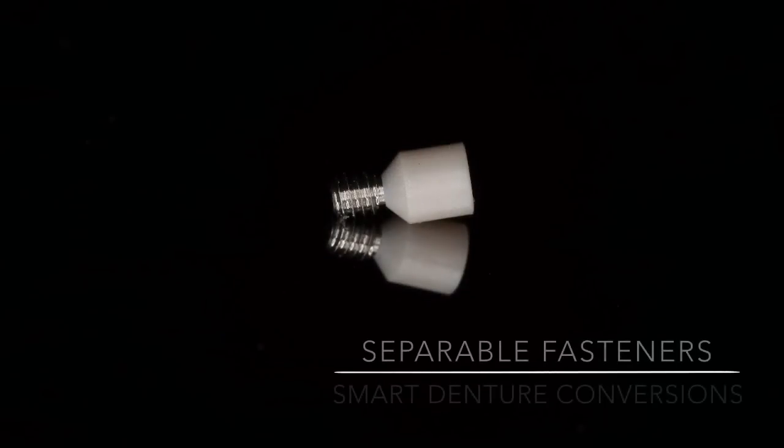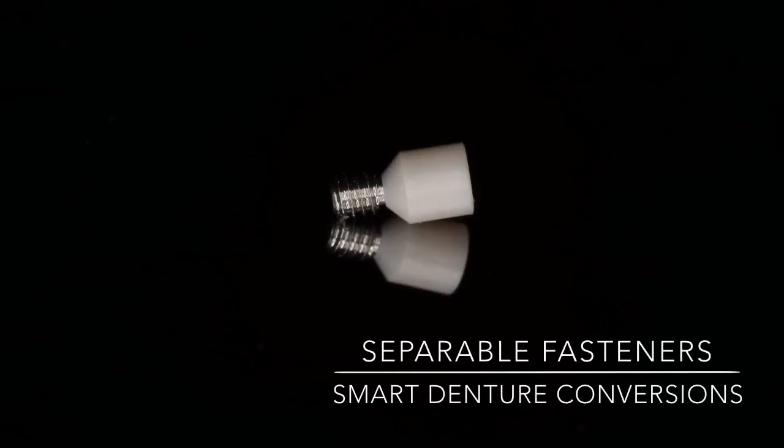And this was all made possible through separable fastener technology developed by SmartDenture Conversions. Stop by SmartDentureConversions.com to pick up your kit today.